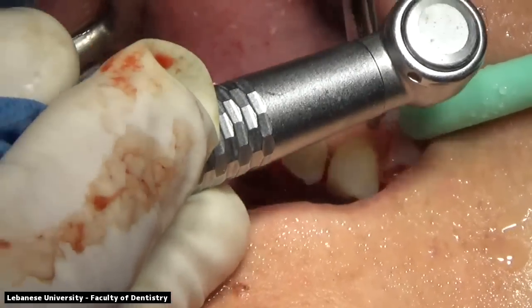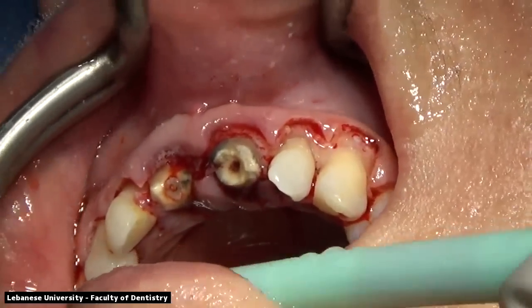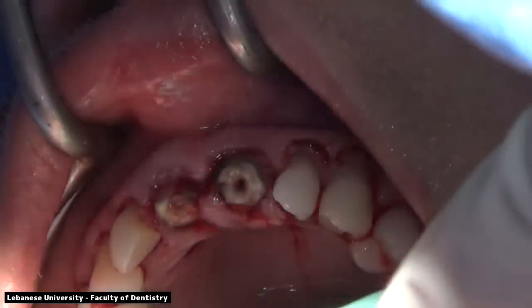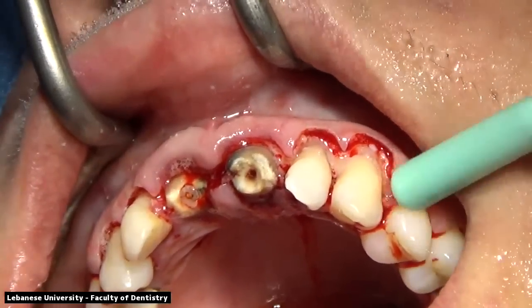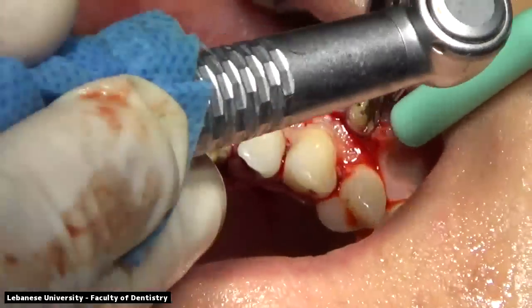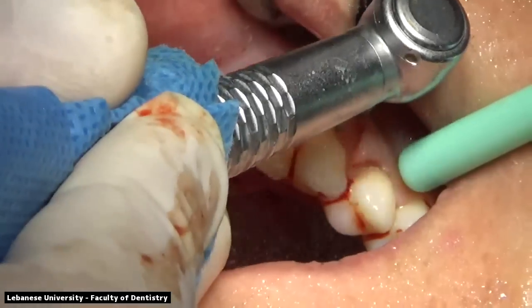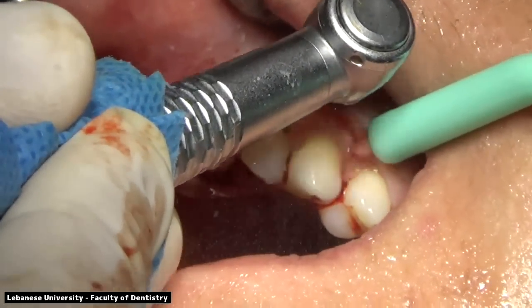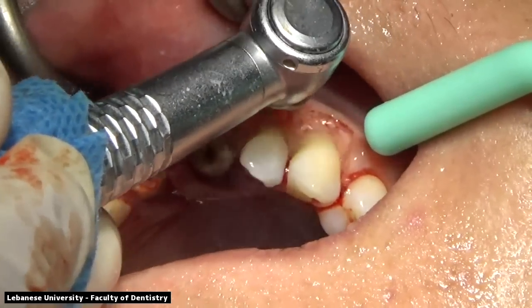So now we're creating the scalloping and the rounding. We're making sure that there are no ledges or protuberances in the bone.